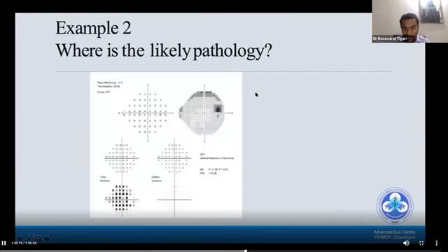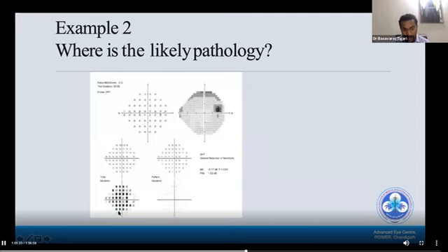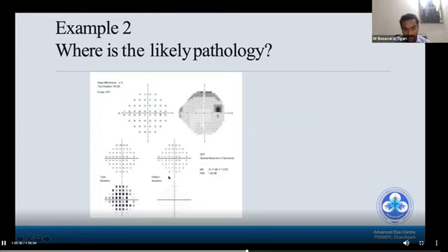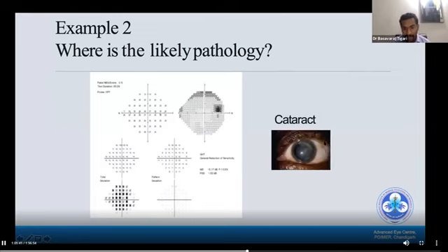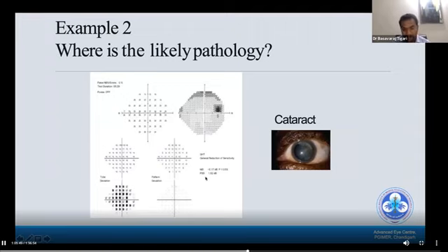Example two: where is the likely pathology? In this condition, the grayscale looks quite okay, but the total deviation shows a totally depressed field, while pattern deviation shows almost nothing — nearly normal except two minor issues. When the pattern deviation is normal and the grayscale is also essentially normal, it means the depression is simply because the patient had a cataract producing these scotomas in total deviation. Hence, I always recommend looking at the pattern deviation plot, not the grayscale or total deviation plot.